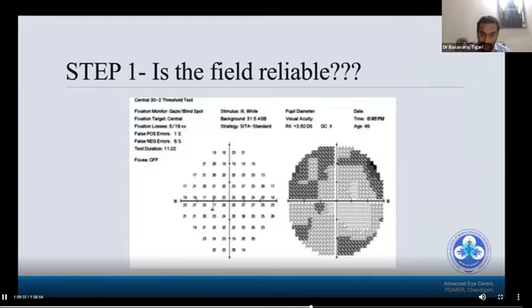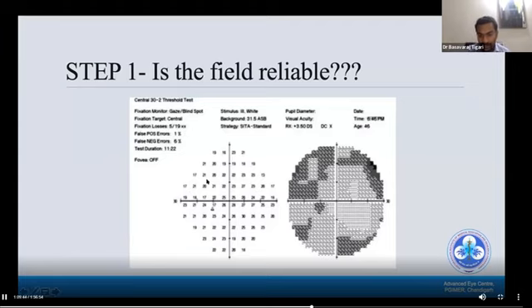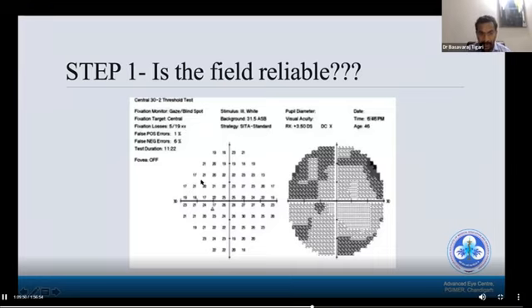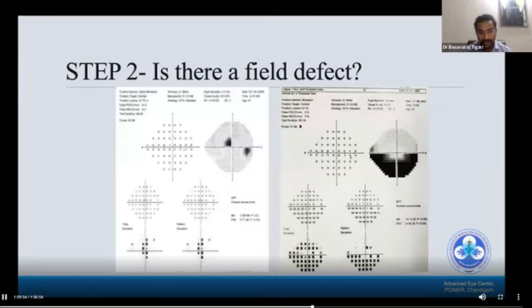Step one: whenever you see a field defect, the first thing to check is whether the fields are reliable or not. In this picture, the fixation loss is 5 out of 19 with a double-X cross sign. Hence the field is not reliable and the test must be repeated.